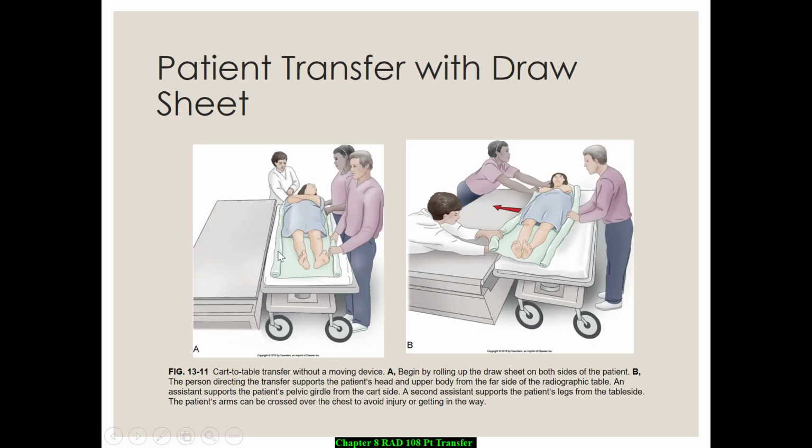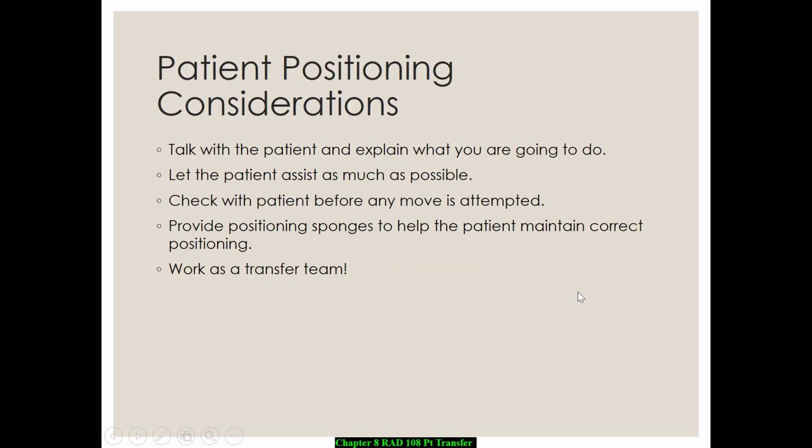So this is an example where they're using a sheet, and you'll see that they're rolling that sheet up to pull the patient across. I do have videos of all of these that I want you to take a look at this week.